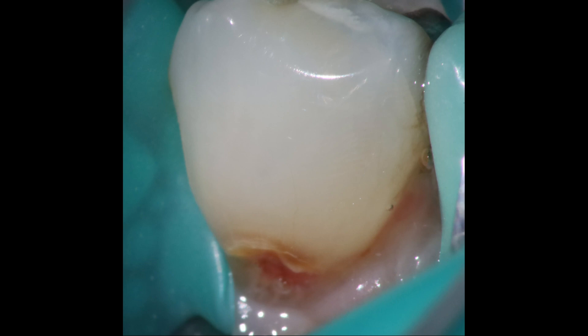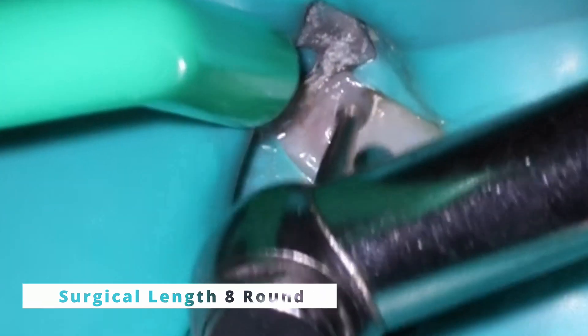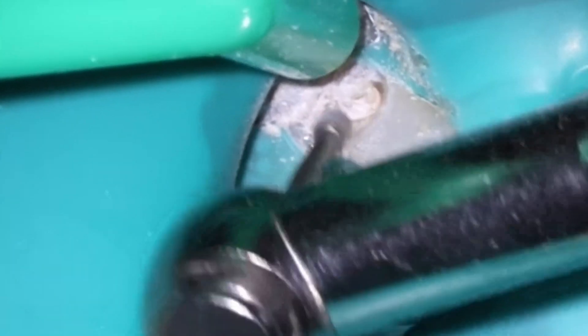Now that amalgam on top there has been there since she was probably a kid — still looks great. So the question is whether or not we need to do a crown on top here. I'll have you answer in the comments: do you think this tooth needs a crown? I actually put a poll out as well on whether or not you think it needs a crown.